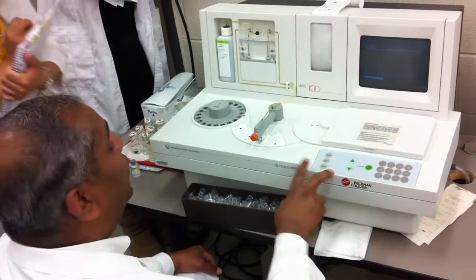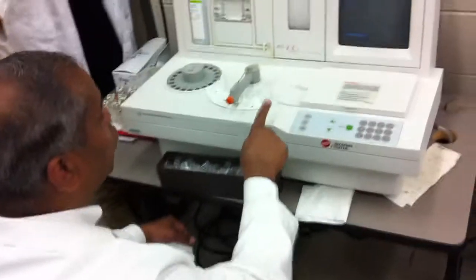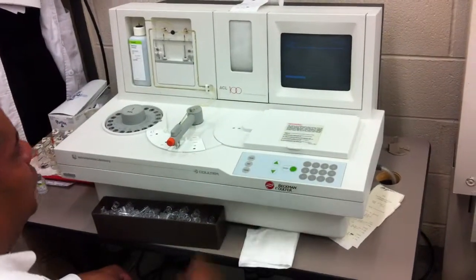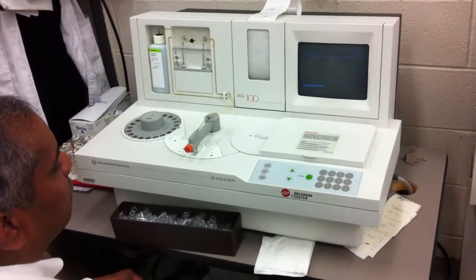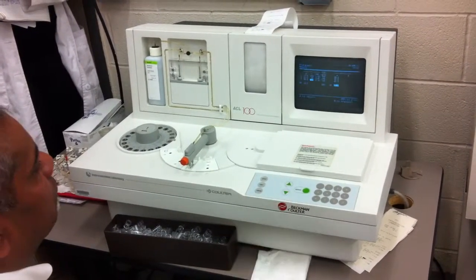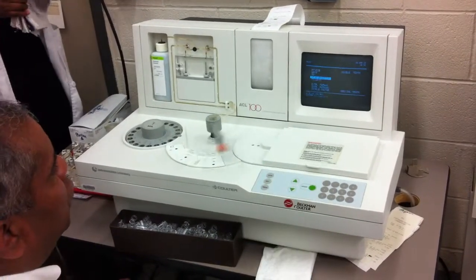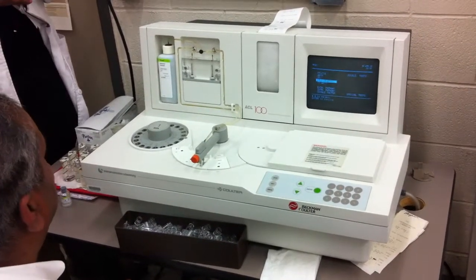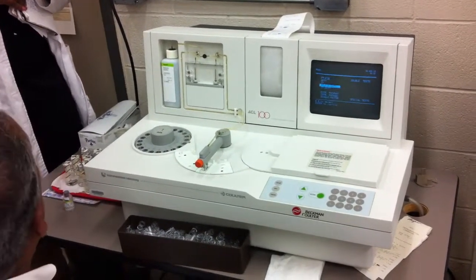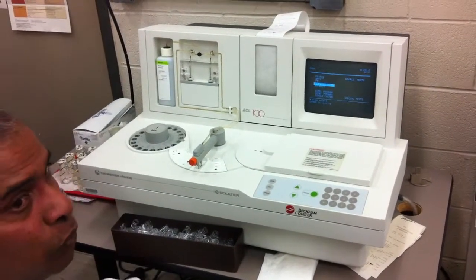All right, so wherever the machine is, if you want to stop the machine and bring it back to the start of the program or the main screen, you press stop and enter. Okay? So stop, enter brings you to the main screen. The main screen is asking you to select what tests you want to do.